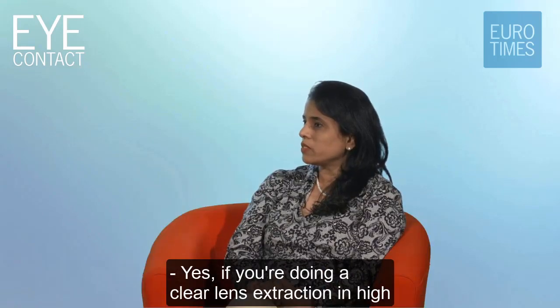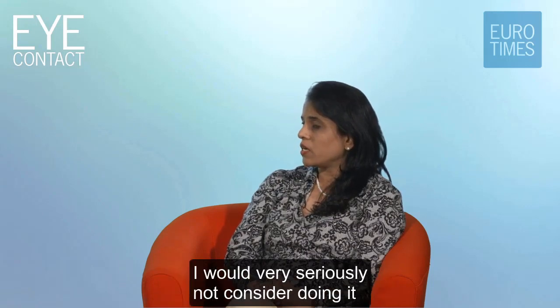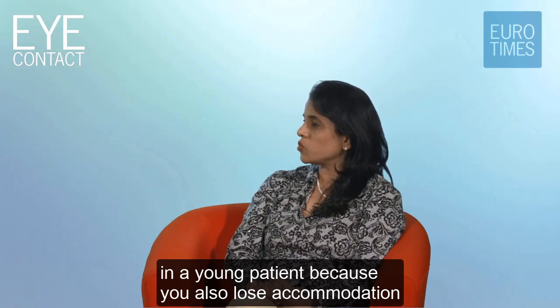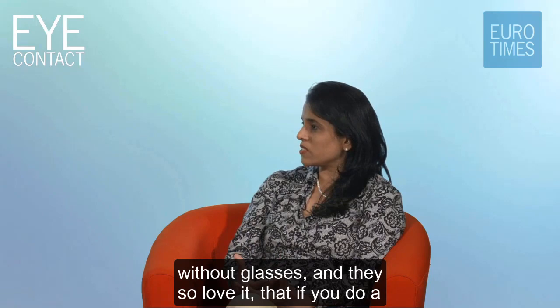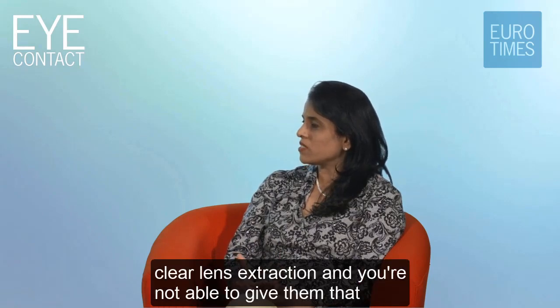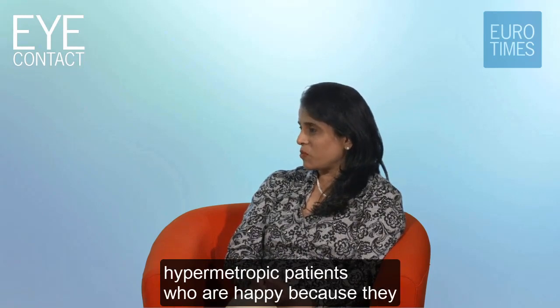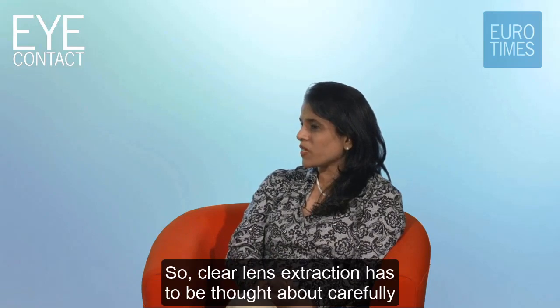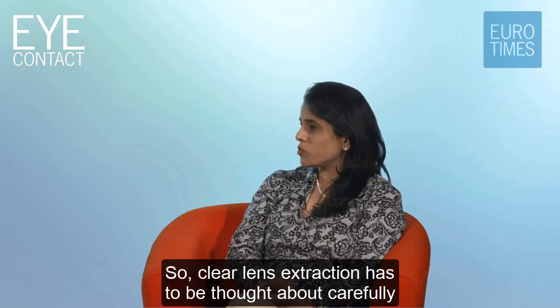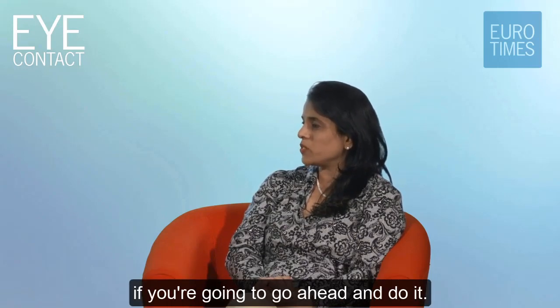Yes, if you're doing clear lens extraction in a high myope, you definitely have to consider these situations. I would very seriously not consider doing it in a young patient, because you also lose accommodation, and these patients are so used to seeing small print without glasses, and they so love it, that if you do a clear lens extraction and you're not able to give them that reading ability, they will be unhappy, very unlike hypermetropic patients who are happy because they couldn't see well at any distance. So clear lens extraction has to be thought about carefully before you do it in a high myope, and also planned very well if you're going to go ahead and do it.